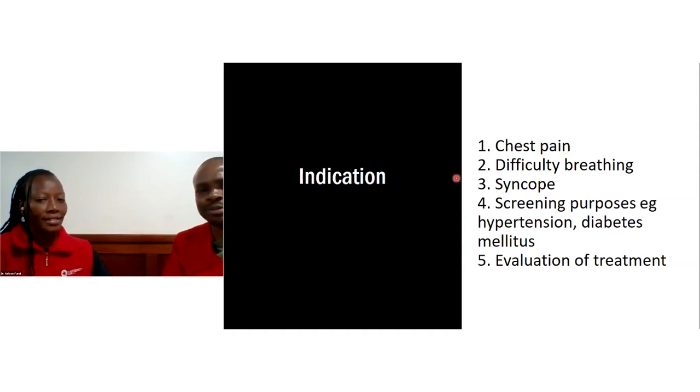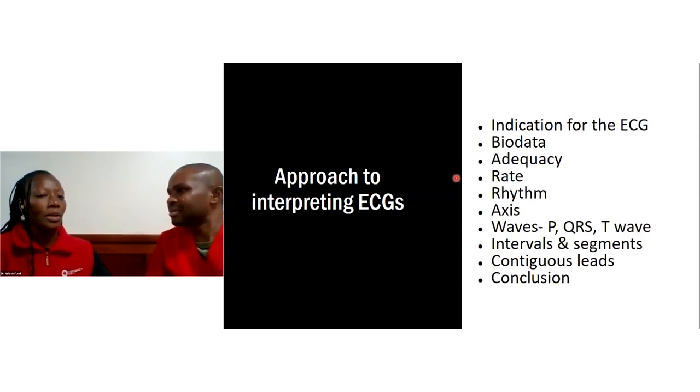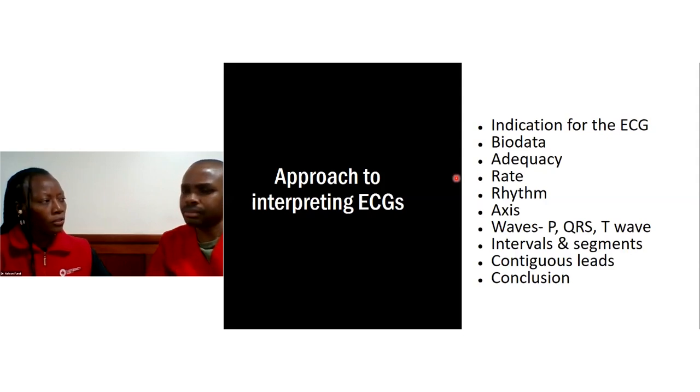All right. Good. So, Dr. Nelson. Yes, Grace. We need to go into approach. We need to approach how to interpret an ECG, and we need to know first of all, where was this ECG done? We have already discussed the indications.